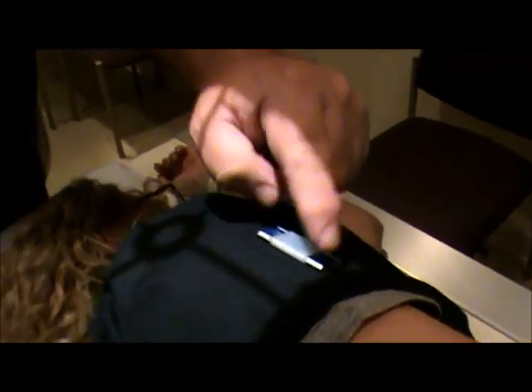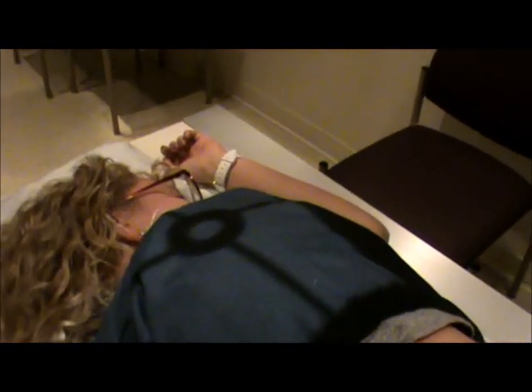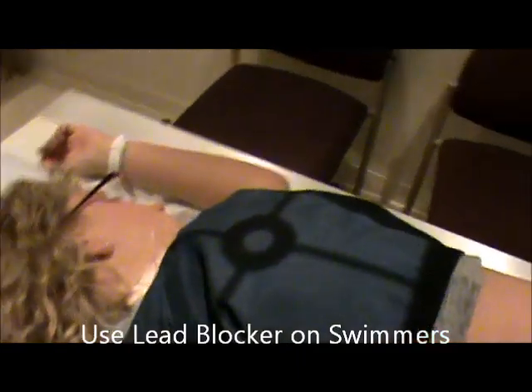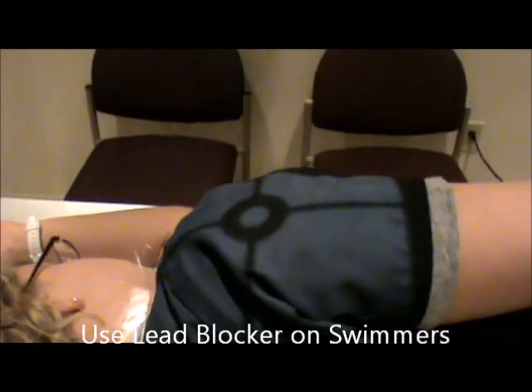One critical area I forgot to mention is marker placement. You can place the marker here on the film, but make sure it's not under the lead blocker — it needs to be in the light field but not obstructing the patient. And that completes our thoracic and dorsal x-ray series.